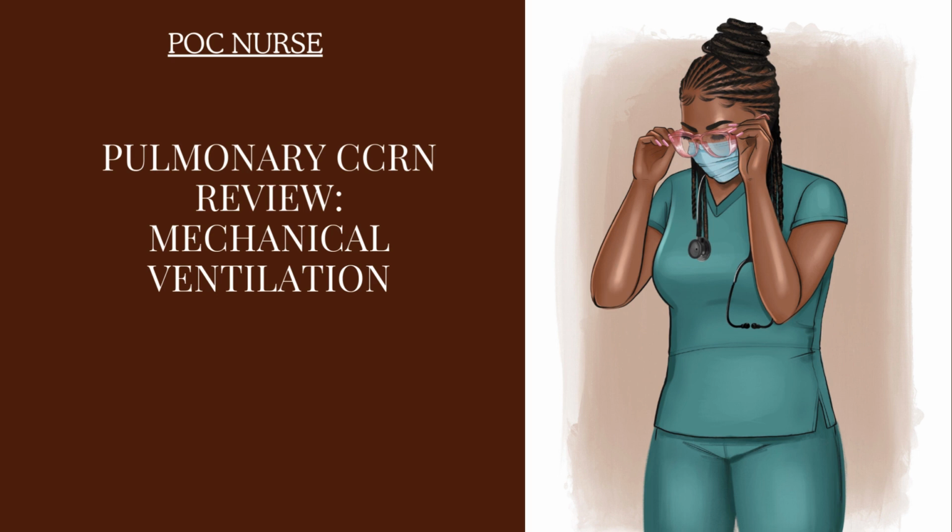Now that is for the ARDS patient. We said low plateau pressure of less than 30 centimeters of water. It's important to know your numbers, because on the test they might not say low plateau pressure, they might give you the plateau pressure in numbers. So we want it to be less than 30 centimeters of water.